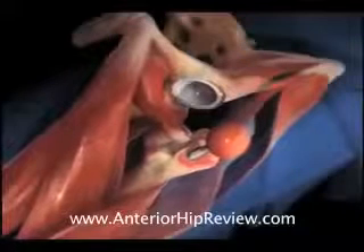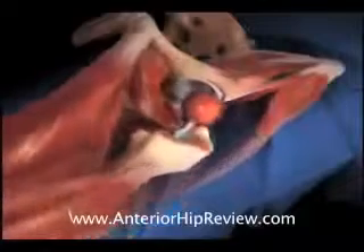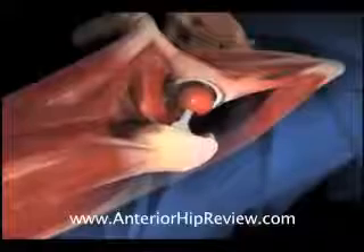At this stage of the operation, we check to make sure that the final fit and fill of all the components is appropriate. The trial components are exchanged for the final implants, and the hip is reduced and the incision closed up.